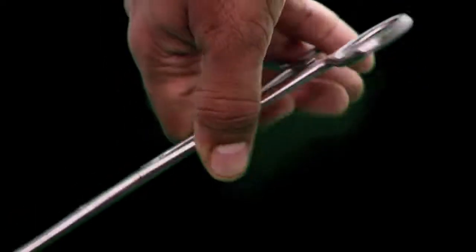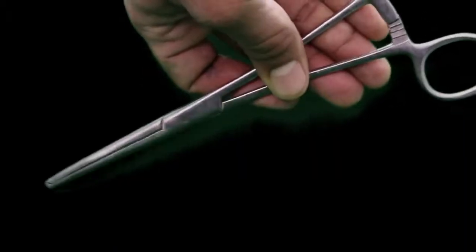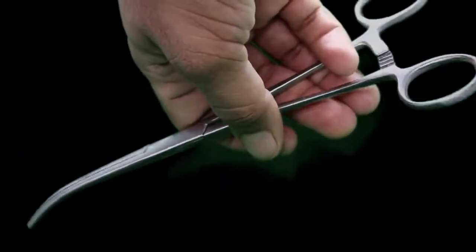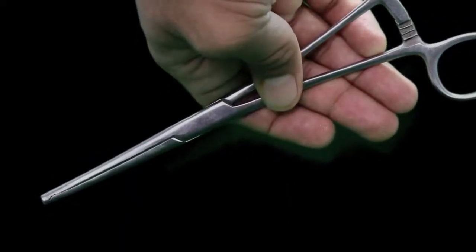These instruments are used to hold the pedicles, especially for the pedicles and also for tough structures, cut end of the muscles, and to hold the gauze base for blunt dissection.